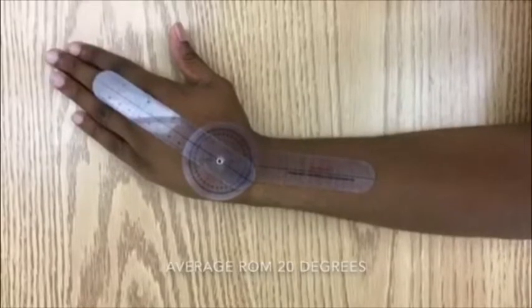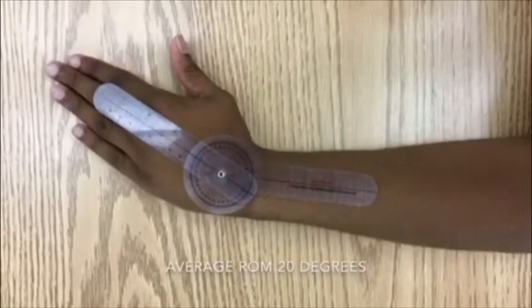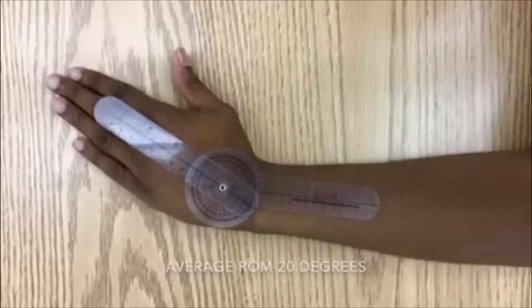This patient measures at 26 degrees radial deviation. Average range of motion is 20 degrees.